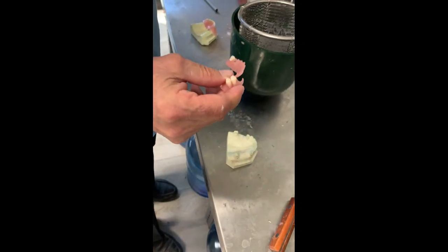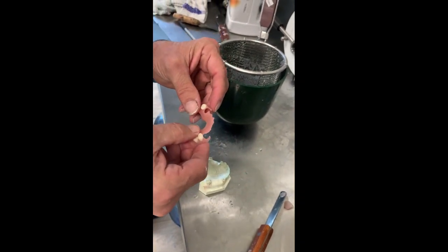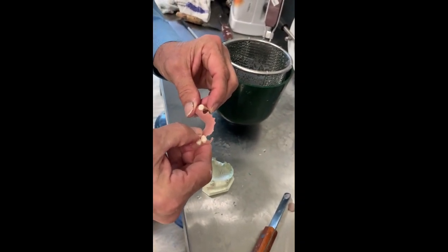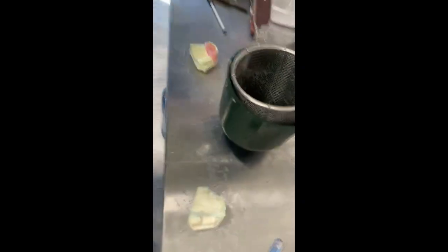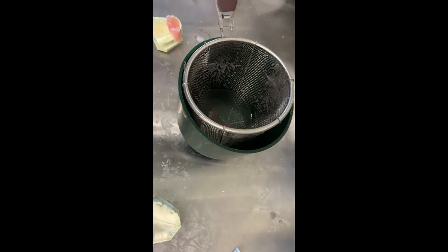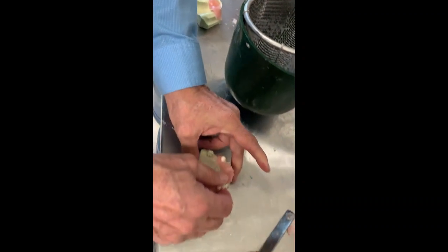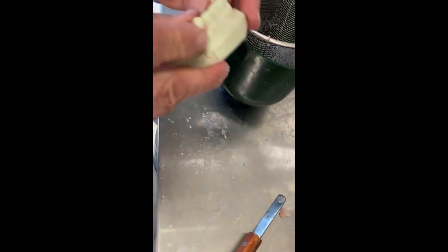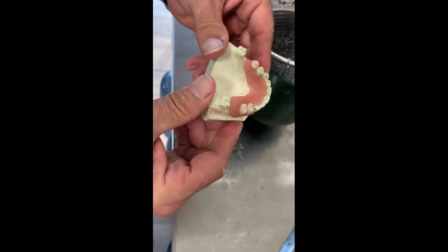But the doctor can actually place a portion of the partial into water and bend the clasp in to tighten it up. I'll show you how flexible this is when you place it in water for probably about 30 seconds. The longer you leave it, the rubberier it gets. Pull it out, and you can see how the partial will bend completely. Place it back on the model, and it adapts perfectly there. When it cools, it will get hard like acrylic.